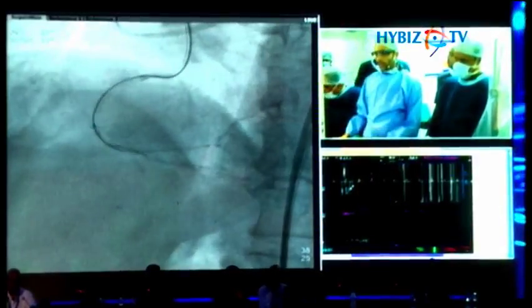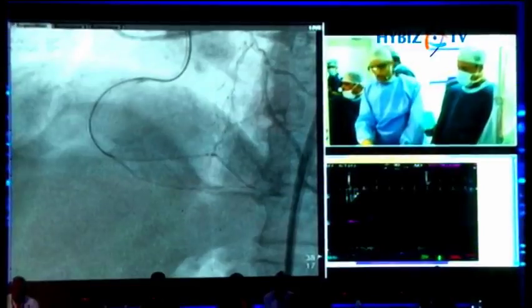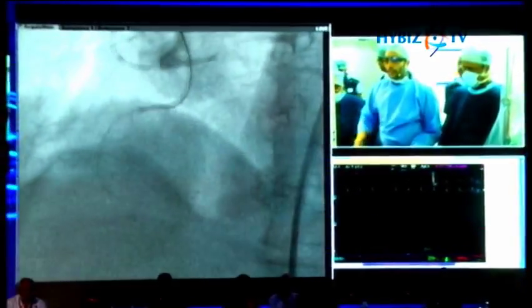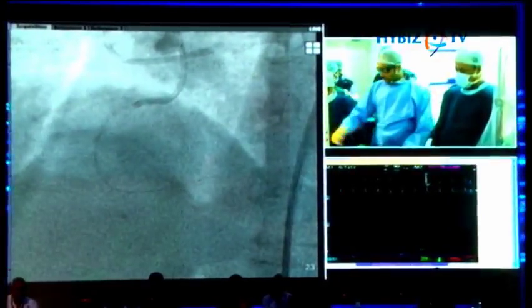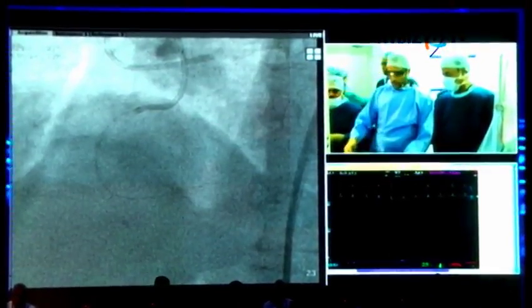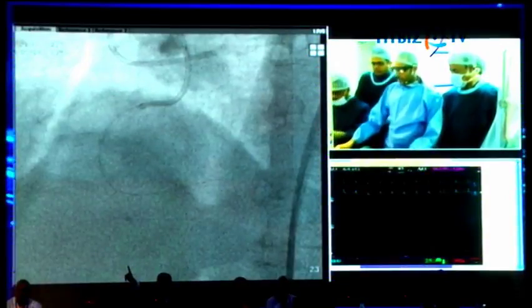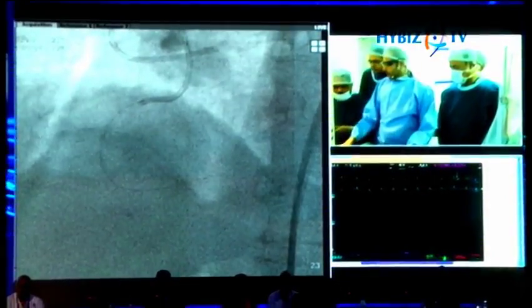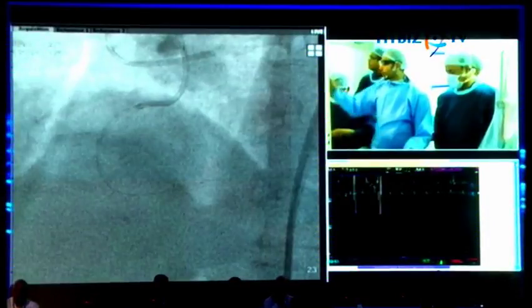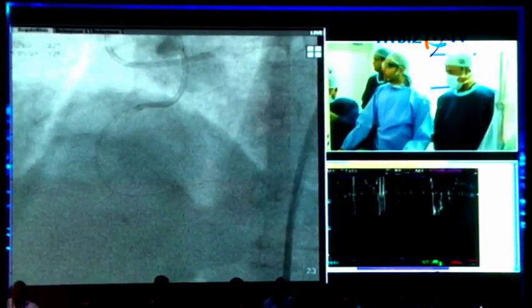Keep it ready. Give me a cyan blue again, that first wire. While you are trying to connect the two, we are going back to Hyderabad, because Dr. Nasu wants to show his case, which he took probably 4 to 5 hours to finish. Vipin, give me a brand new cyan blue and turn that light off.